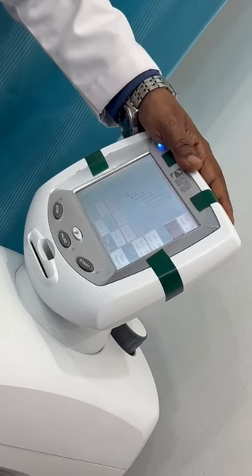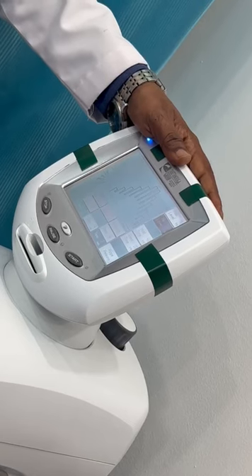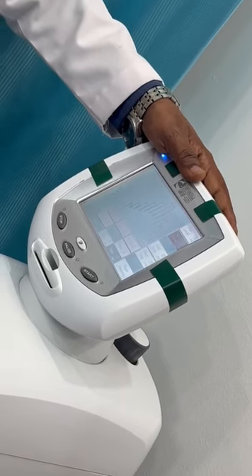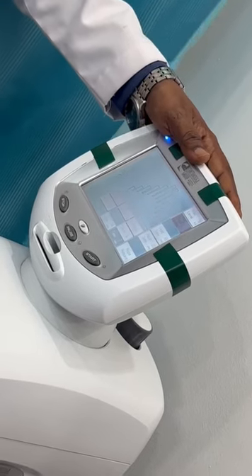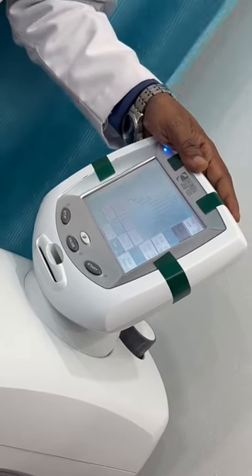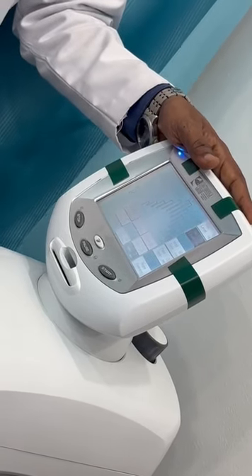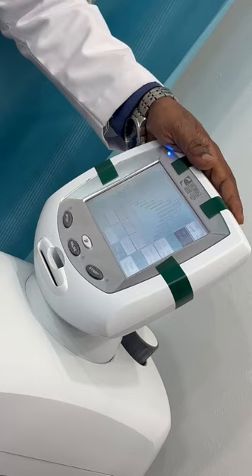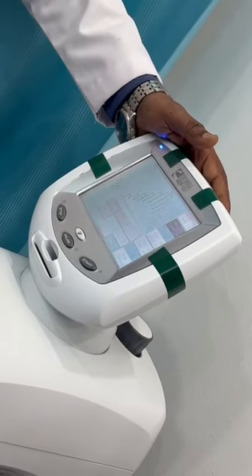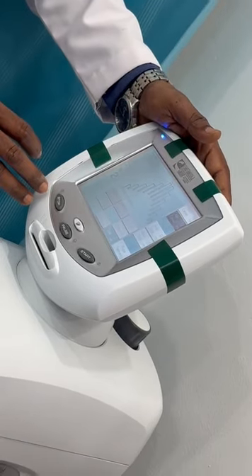But if there is no muscle spasm and only the disc is compressing, in that time we will use only static. Usually static mechanical traction we will use in an orthopedic setup. If there is muscular involvement you cannot keep it continuously. Anyway, you should know how to set the intermittent. You keep all these settings in intermittent, progressive, intermittent step.